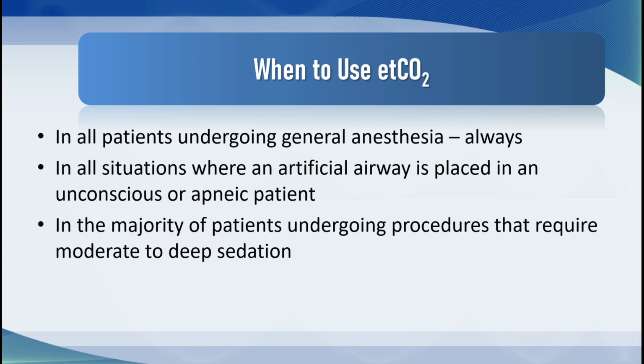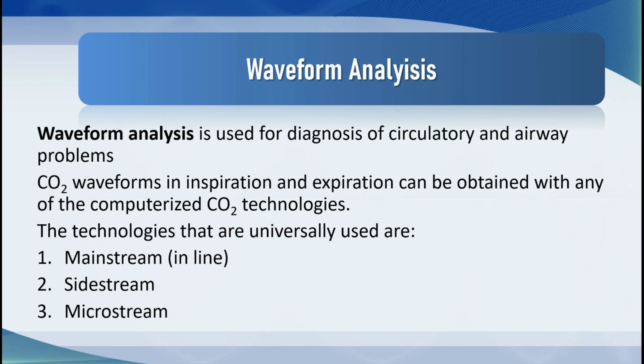In addition to just measuring end tidal CO2, there is tremendous value to performing waveform analysis, because looking at the CO2 waveform both in inspiration and in expiration, we can diagnose a whole host of circulatory and airway problems. And CO2 waveforms are generated by all devices that are plugged into monitors these days that measure CO2. They are the mainstream devices that I've already discussed, the inline devices, sidestream devices, and microstream devices.